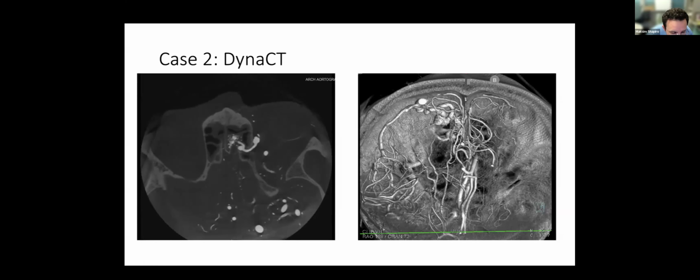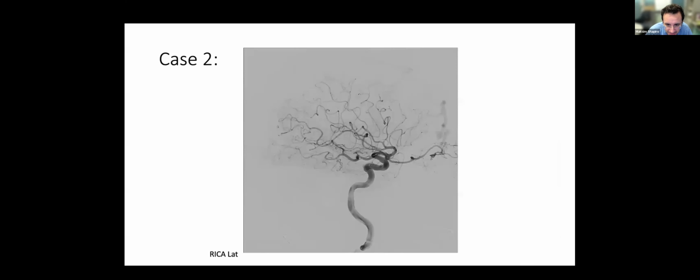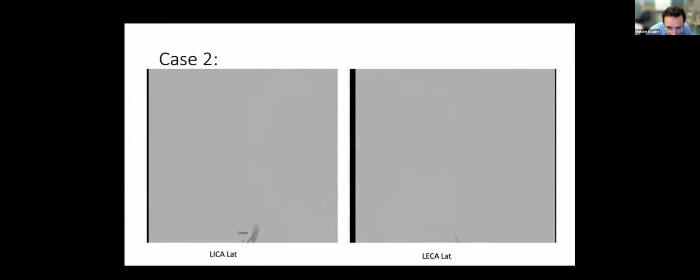Super interesting case. There's a couple of comments on the chat. Keisuke is saying there was a posterior drainage through the olfactory vein, maybe pre-surgically. Sometimes there are several veins draining it. You could see there's also a lateral frontal vein there, if you review this again.